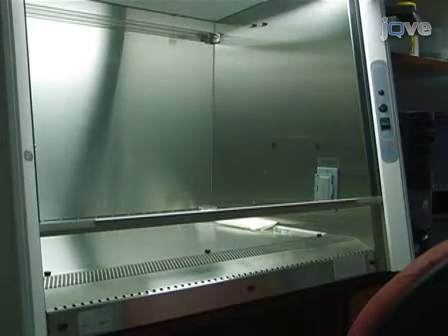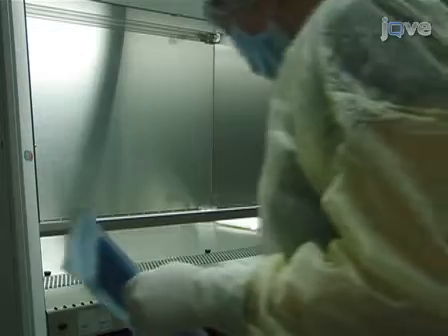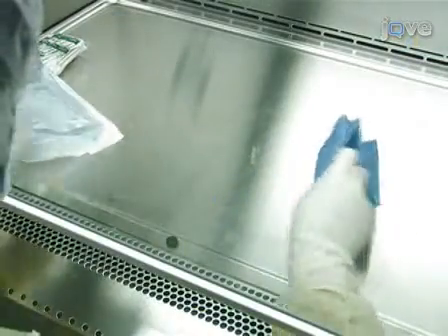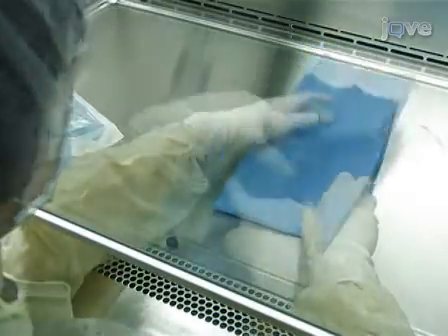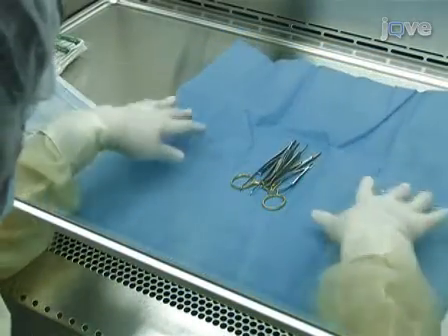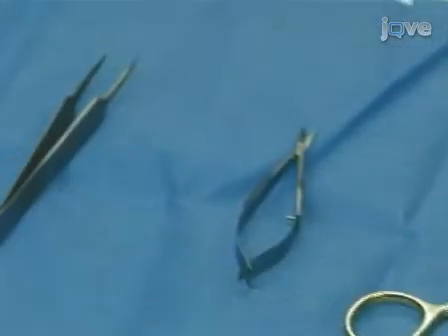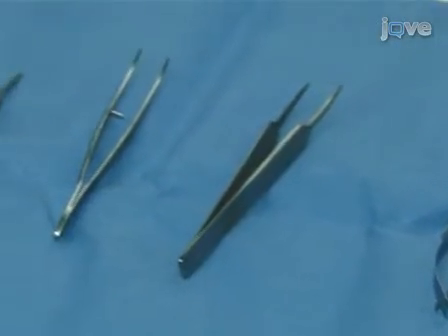To begin, prepare a sterile space for the surgery by laying down a piece of sterile cloth inside a sterile hood. Put a piece of sterile gauze in the middle and gather the items you will need for the surgery. You will need a pair of small and a pair of large dissection spring scissors, micro-dissecting tweezers and forceps, and a needle holder.